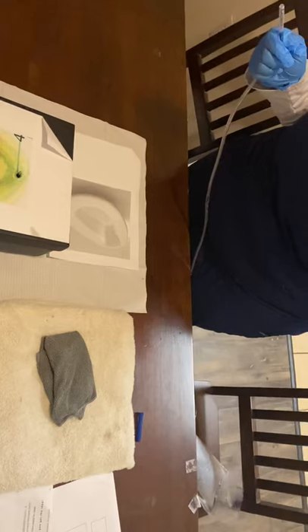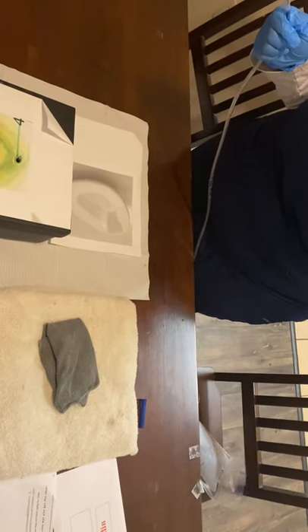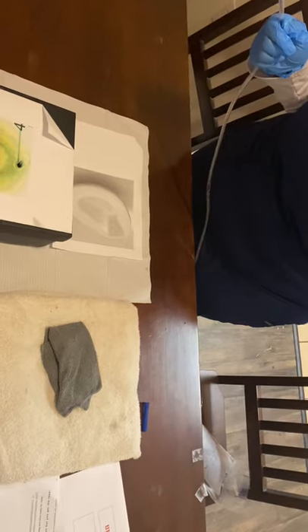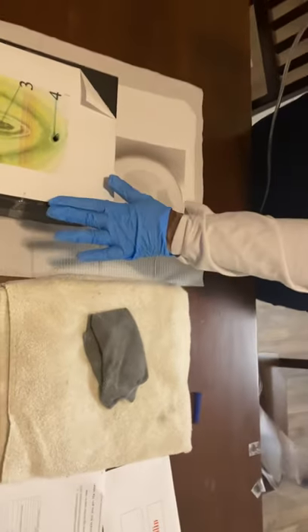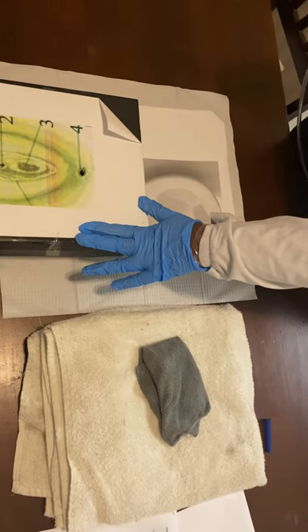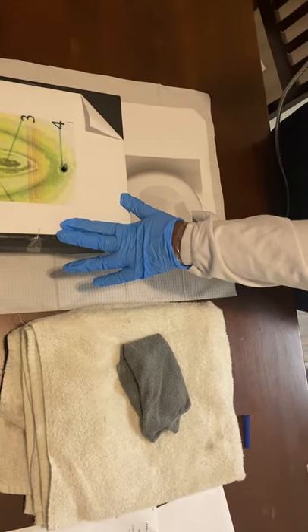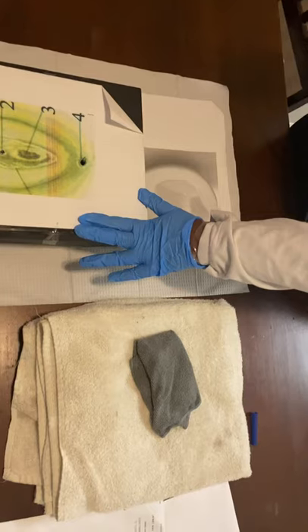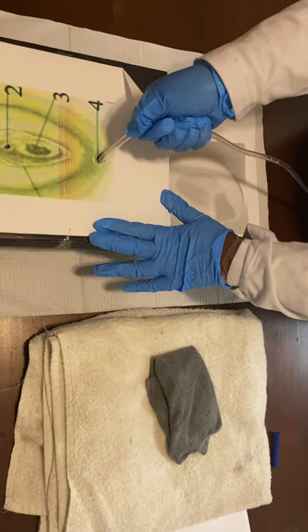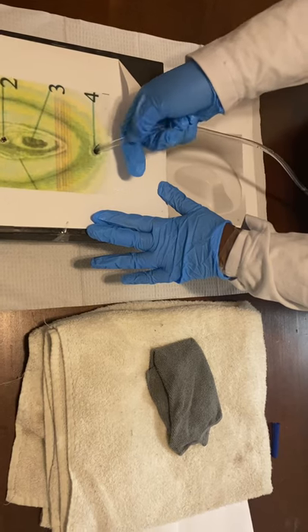I'm going to get ready to lubricate my tubing. I'll take this off and I will lubricate with my non-dominant hand. Then I'm going to tell the patient to take a deep breath while I get ready to insert three to four inches into the rectum. I'm also going to place my hand on their hip and tell them that if they have hemorrhoids, they can bear down during this procedure to make the process easier.